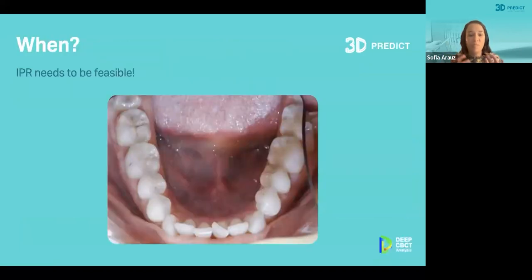So when do we do IPR? We already touched on the why. When do we do it? IPR needs to be done when it's feasible. That's the first point. We get the question from a lot of providers: can I just do IPR on the first step? Why do I have to have the patient back, let's say in step 6 and step 12, and do IPR in 3 different appointments when I could have done the IPR all in one step?